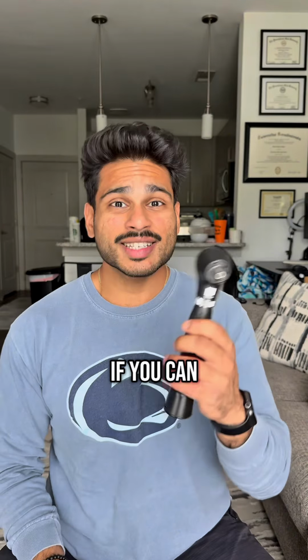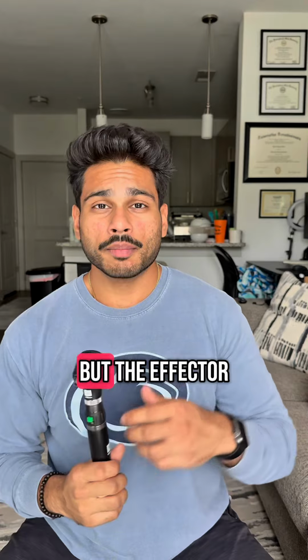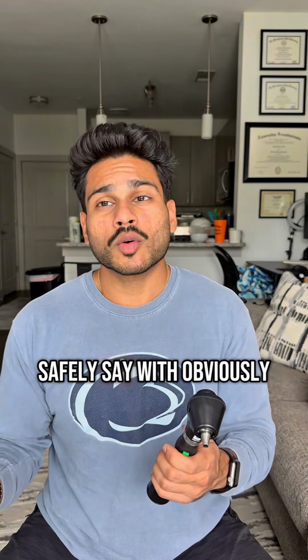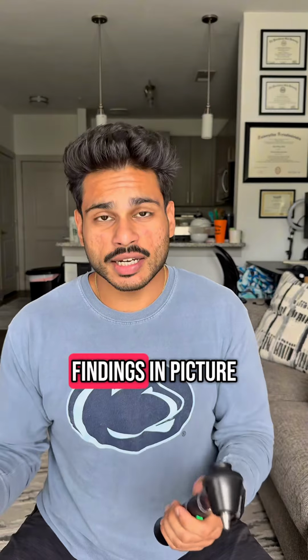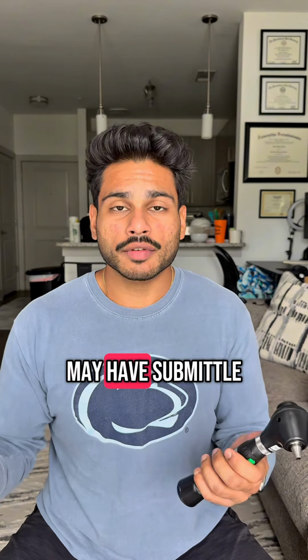If you can see the tympanic membrane and the cone of light, but in the affected ear you cannot see the cone of light, then assume that there is a lot of fluid behind the ear. And you can safely say, with obviously the other clinical findings in the picture, that this patient may have some middle ear infection.